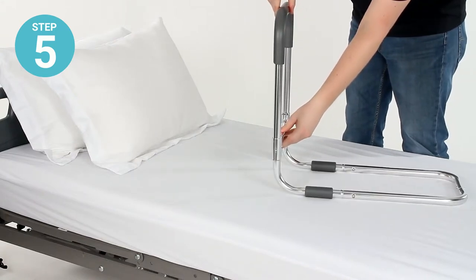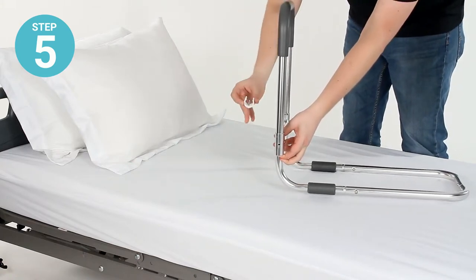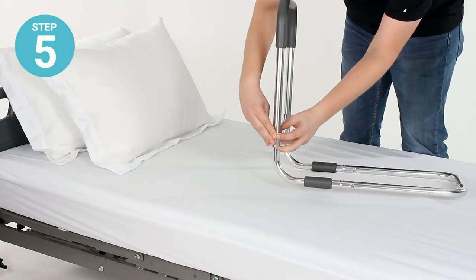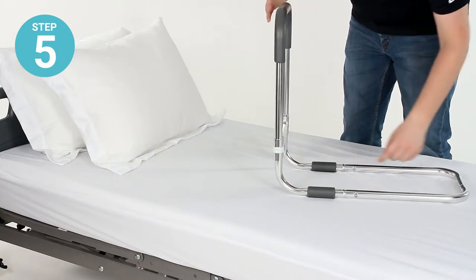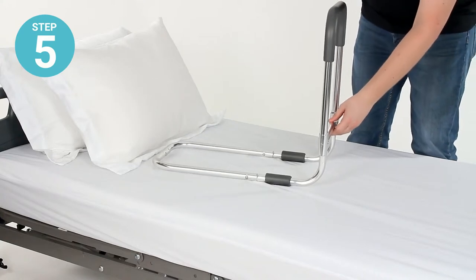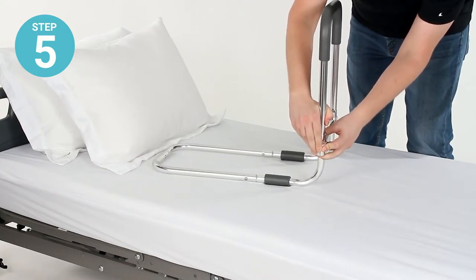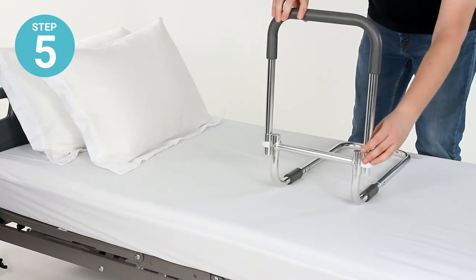Lift the grip rail up so that the pin holes are aligned, then take one of the locking pins with its plastic collar and fit it into and through those two pin holes. The pin goes through, the plastic clip clips onto the outside of the crossbar and secures one side — then do the other. Once those are clipped on, you're all set.